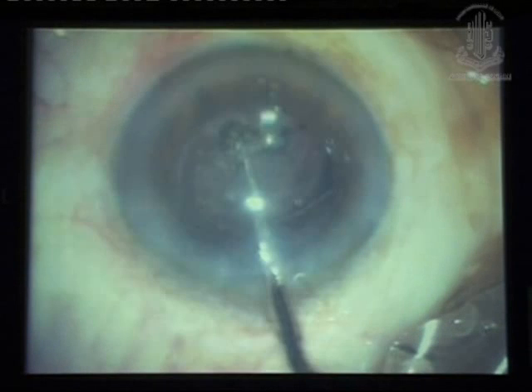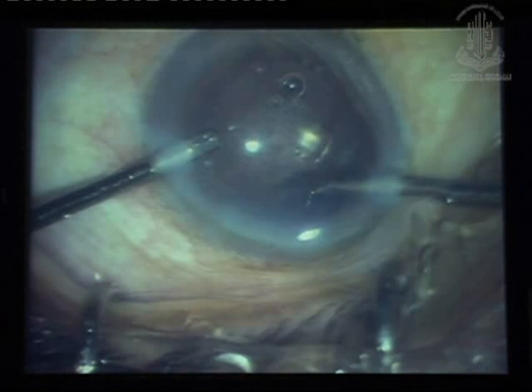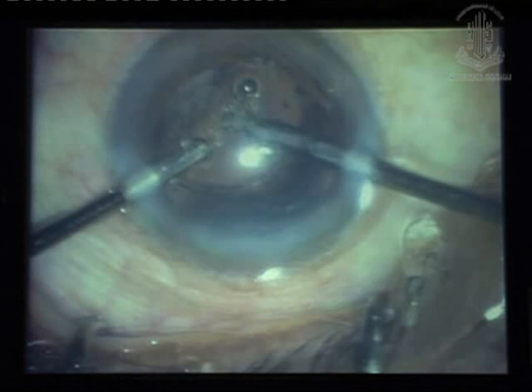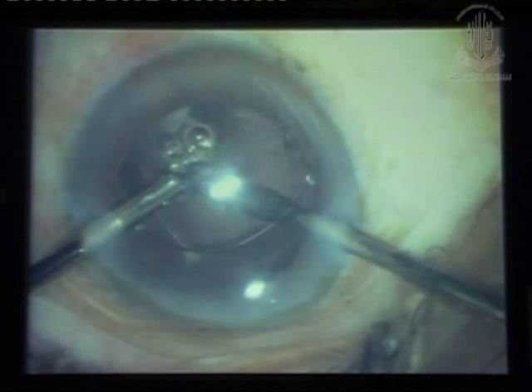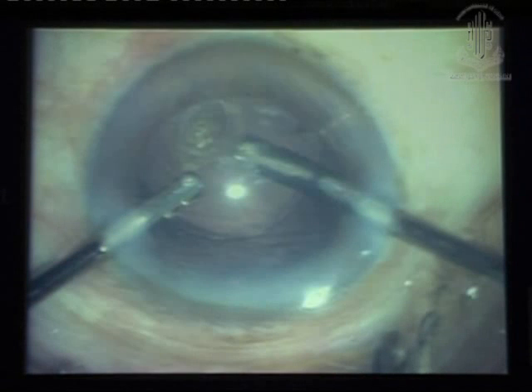I must remind you, generally if you leave this lens like this at this stage, you are going to have pigment dispersion, chafing and glaucoma. But I am ensuring that there is no vitreous anywhere. In fact, I am working now behind the lens. I am doing the vitrectomy behind the lens, making sure and removing all the viscoelastic that I had put in. Now I come anterior to the lens.